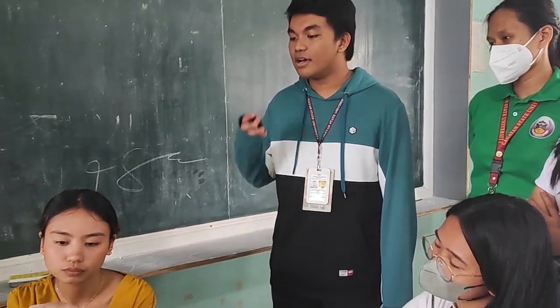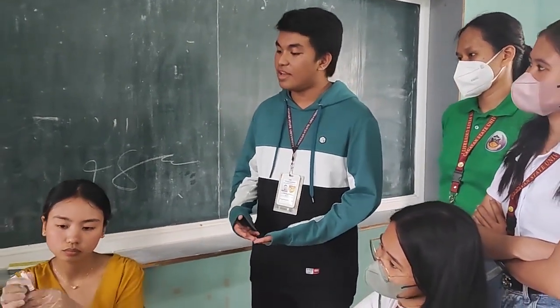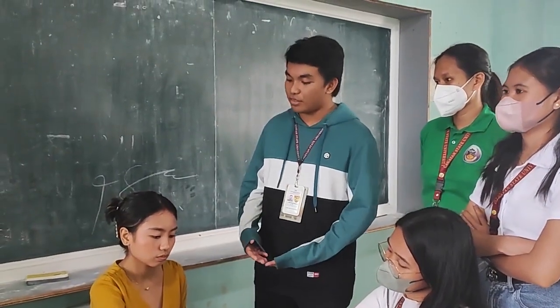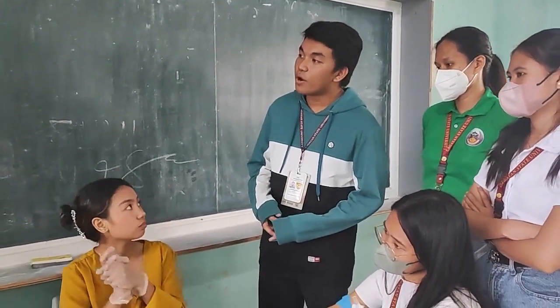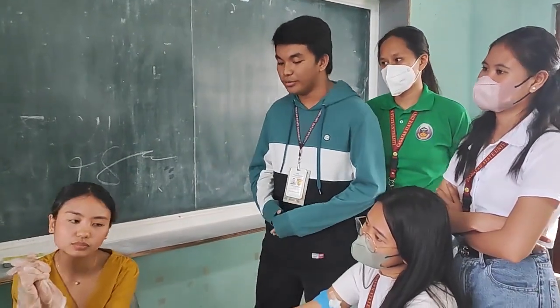According po kanina sa lesson natin, and according din dito sa ating scenario, ang uunahin nating tests ay APTT at saka PT. Since gagamitan natin siya ng blue, and sabi natin kanina na mauuna yung blue. And then the next one naman po is yung red na gagamitin natin for sodium test. And then the last one naman po is yung lavender top natin na lalagyan po natin ng specimen for ESR, HH, CBC, and platelet count po.